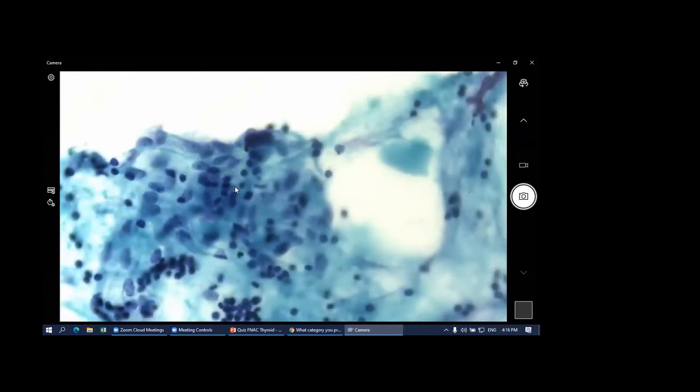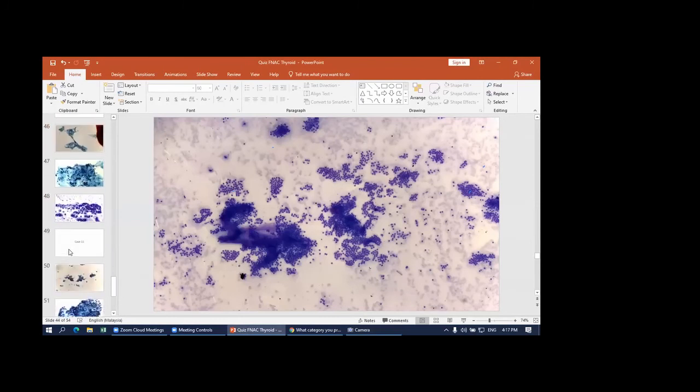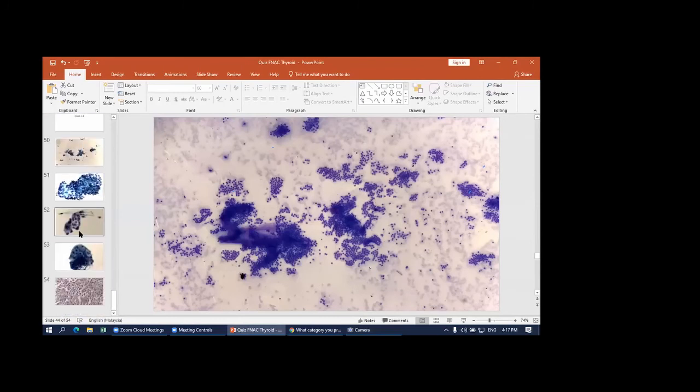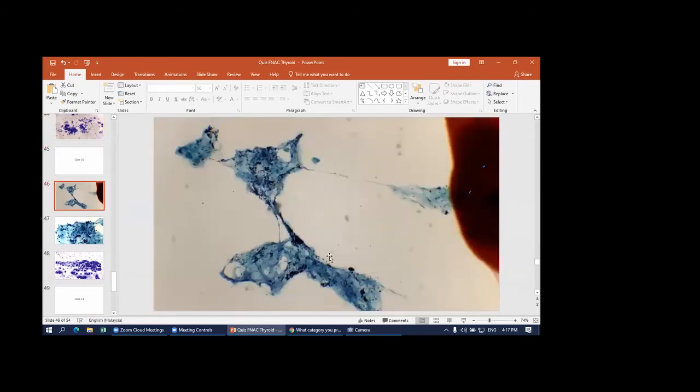Can you see that? Nampak tak? There are some pale cells. Yes, don't be excited. Granuloma pun ada. You might be correct. Okay, let's look at the granuloma. Sabarlah. What is he saying? He speaks slowly.